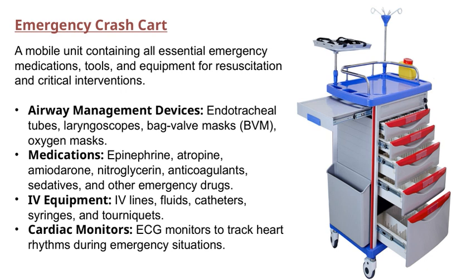The IV equipment section includes IV lines, fluids, catheters, syringes, and tourniquets. This setup allows us to establish and maintain IV access rapidly, administer fluids, and deliver medications directly into the bloodstream.